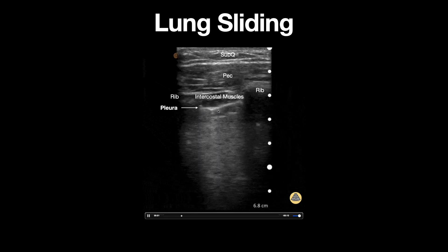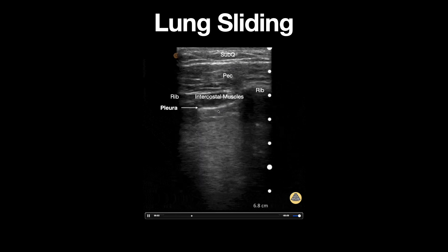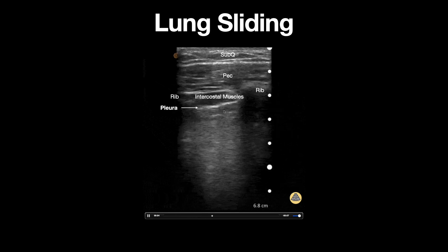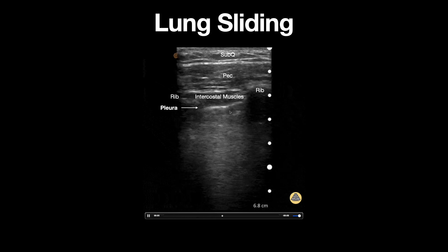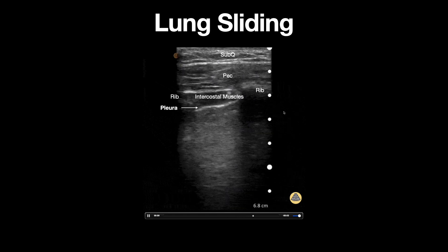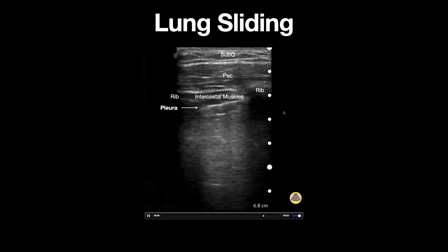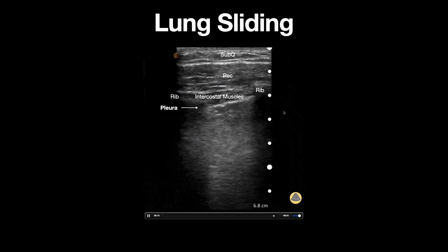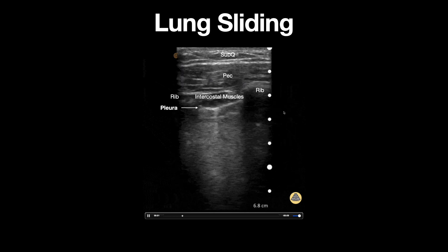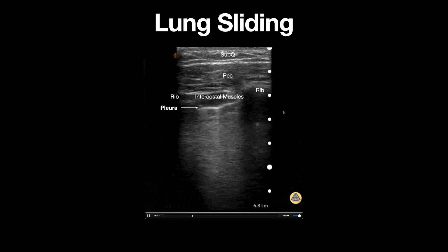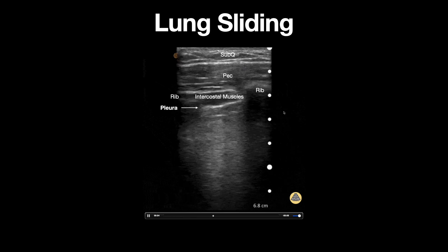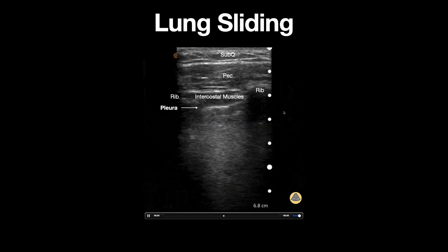Notice that this pleural line is hyperechoic and can be seen shimmering and moving back and forth. Others describe this as if ants are marching on a line. Lung sliding is a normal finding and represents the parietal and visceral pleura moving against each other.